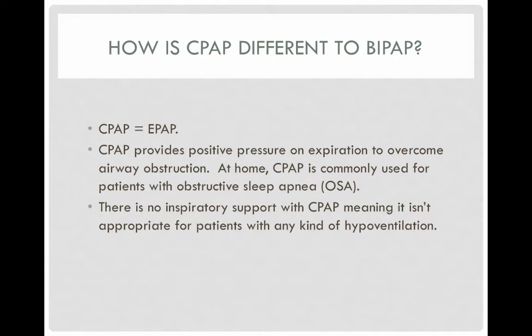So their entire inspiration is based fully on the patient. Primarily, this is used for the treatment at home of obstructive sleep apnea. In the hospital, the main time we're going to use it is on patients with heart failure that really need the most improvement with oxygenation.